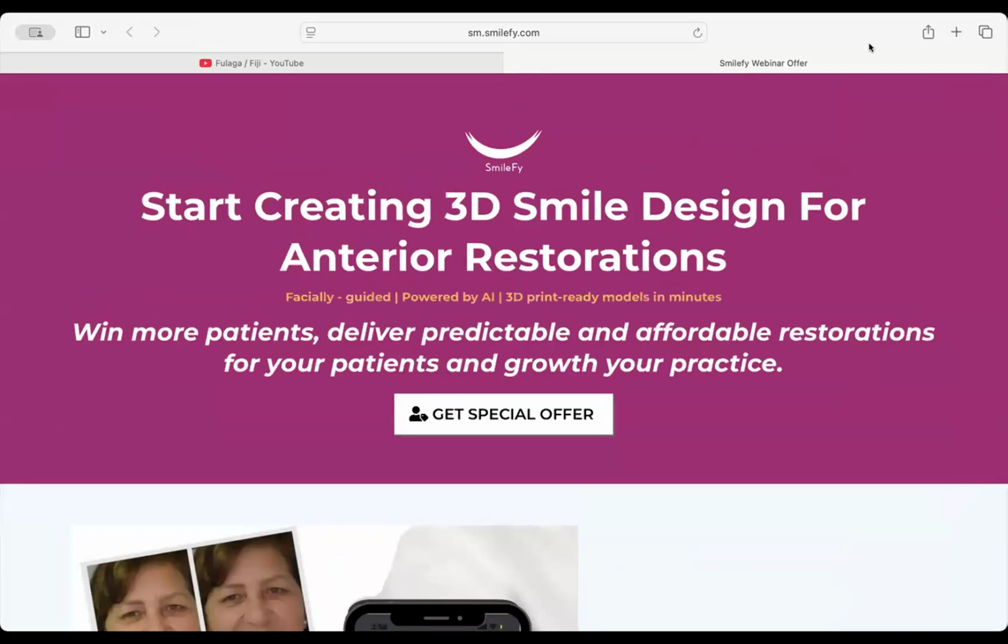For, of course, ceramic veneers, pressed veneers, and all this other stuff, you have a very, very good platform to communicate with your lab technician and take over the design and then prepare everything. We have for you a complete course, digital and in person, but we will help you step by step. Easy cases, and then grow your expertise with every single case.